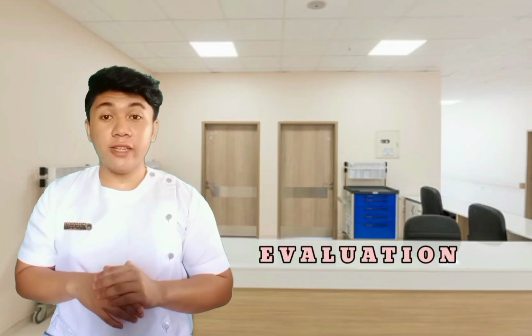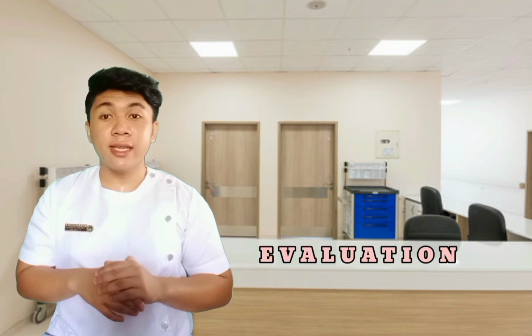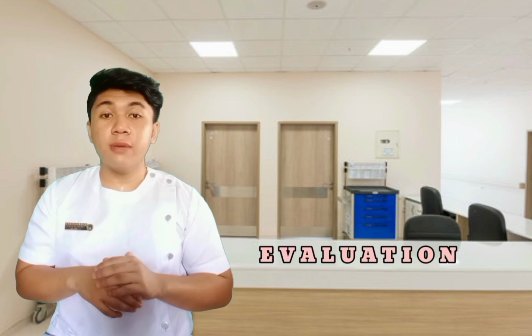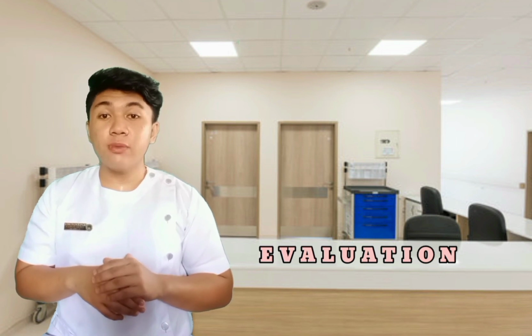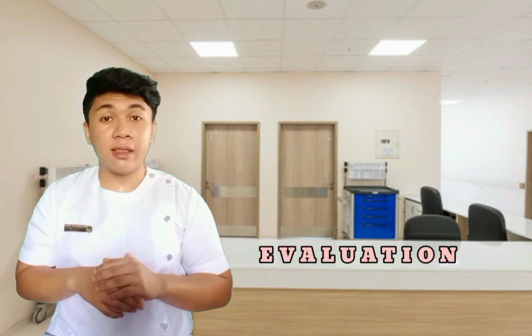For the evaluation, first, patient tolerates feeding well and weight is maintained or increased. Second, appropriate residual is obtained from aspiration of stomach content. Third, patient complies with feeding procedure. Fourth, intake and output balance is maintained. Fifth, nasogastric tube functions efficiently and remains patent.